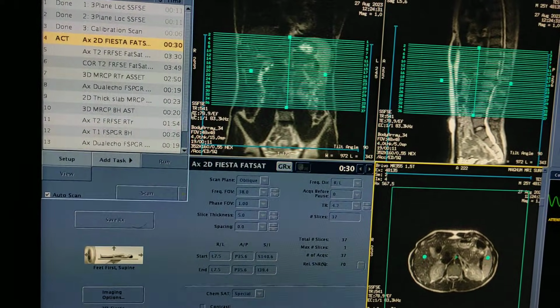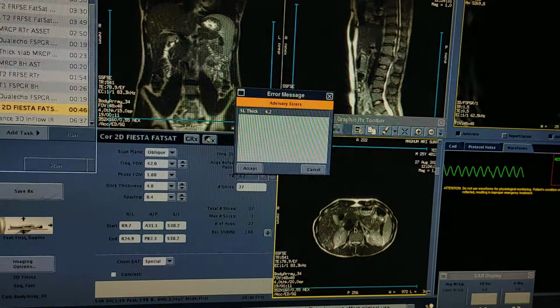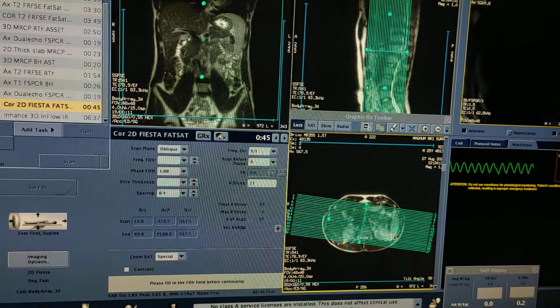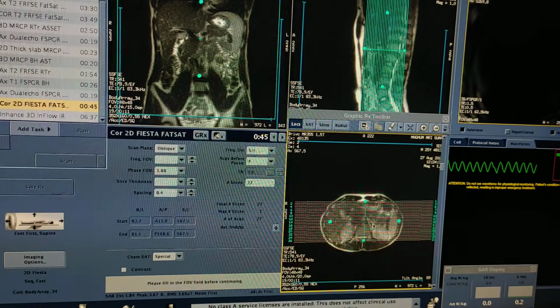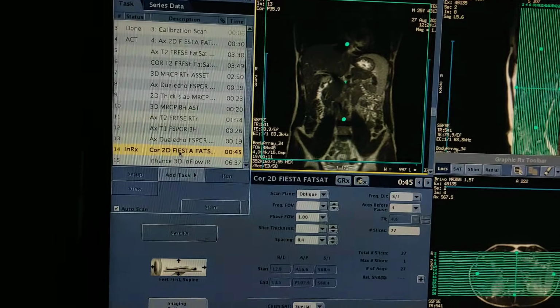Same way I will plan a coronal 2D FIESTA. Instead of planning over a localizer, I am taking a 2D FIESTA to plan the other sequences. I will click on the coronal 2D FIESTA.